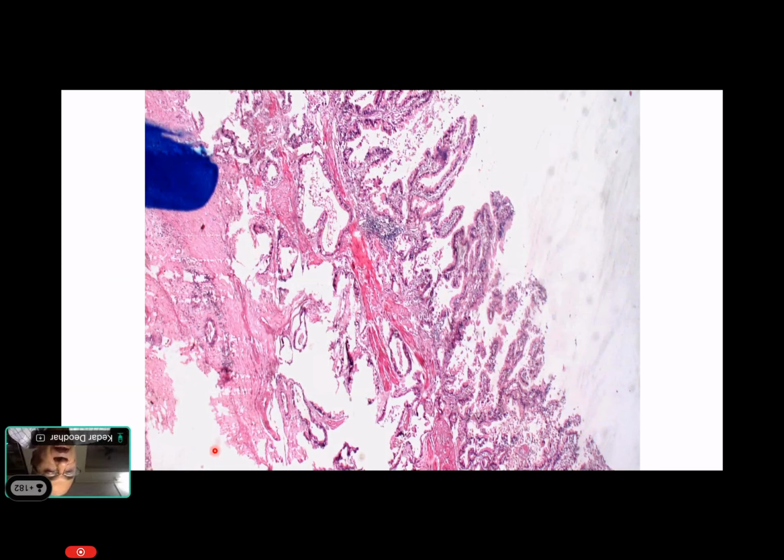If you have liver parenchyma on the external aspect, and if you see tumor glands going into the liver, then we can call it reasonably pT3, but that often is not the case. But often we can see it is beyond the muscle coat. pT2a is at least the stage.